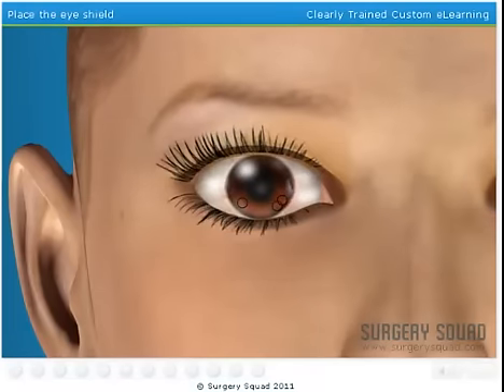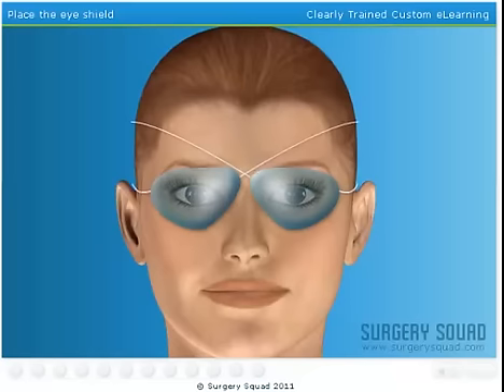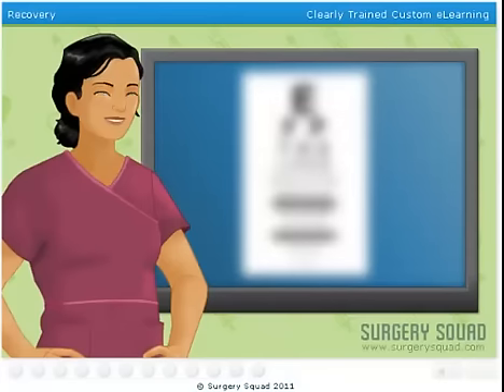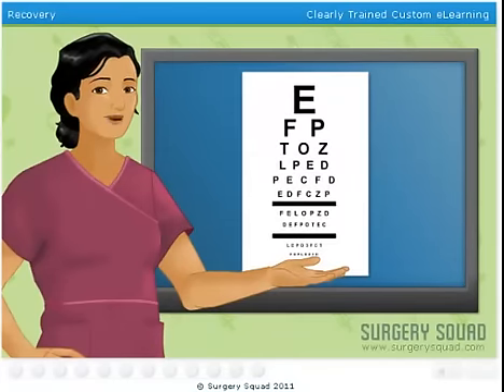Even with the corneal flap bonded back in place, the cornea is still vulnerable and could dislodge if the patient isn't careful. That's why we put a clear protective shield over each eye — this keeps the patient from bumping or rubbing her eyes. The patient will notice the improved vision immediately, or as soon as the numbing drops wear off.